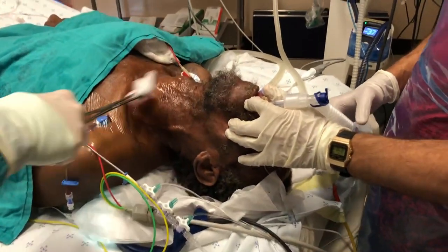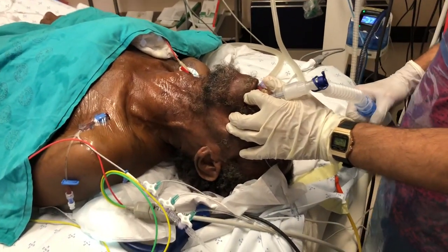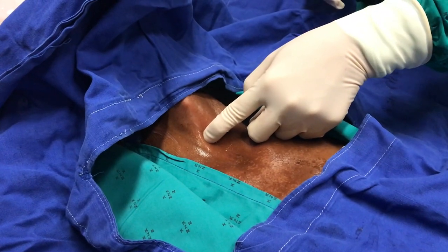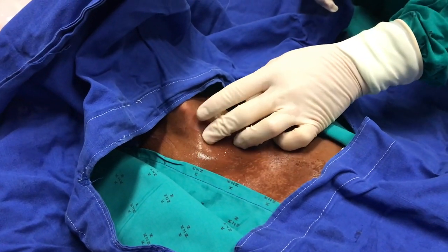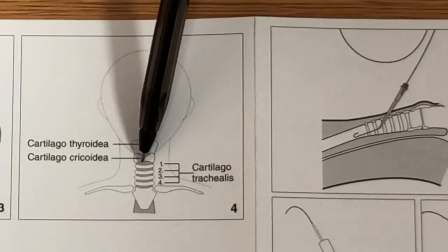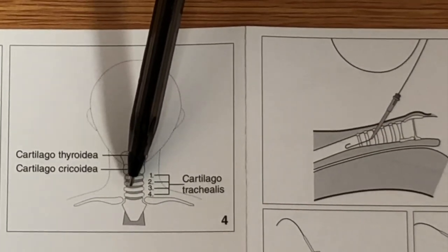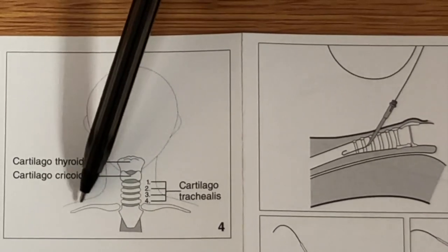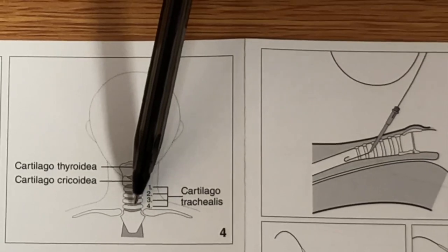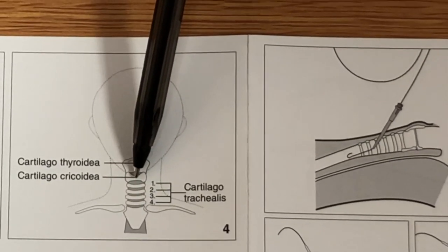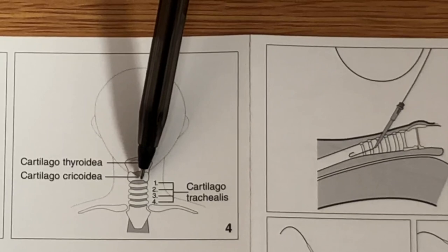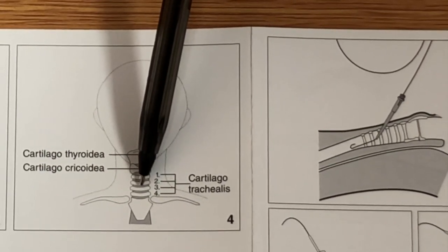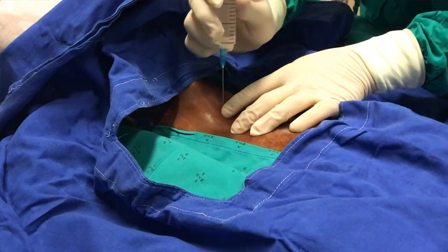Once positioned, look for the landmark which is ideally meant to be the space below the second tracheal ring. Count from the cricoid: first ring, second ring, the space between the second and third tracheal ring. If you have a patient who is hyperinflated, the space is limited and may have to settle for halfway between the manubrium and the cricoid, but ideally we should be aiming at the second tracheal interspace.